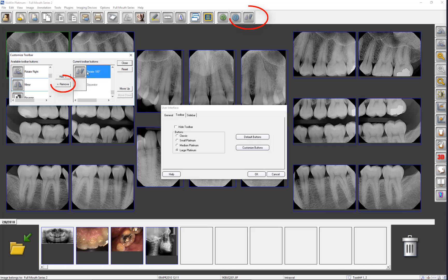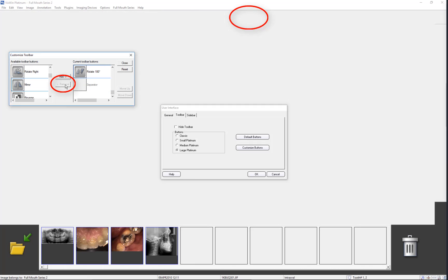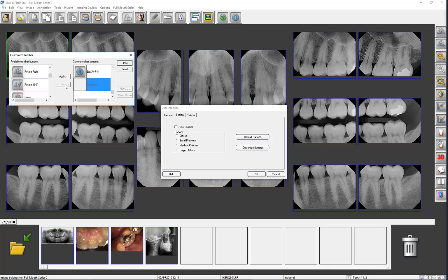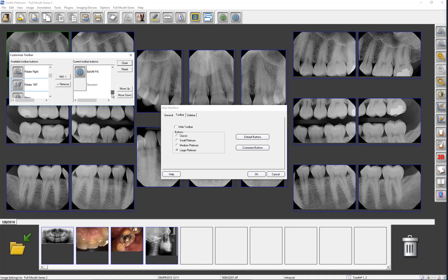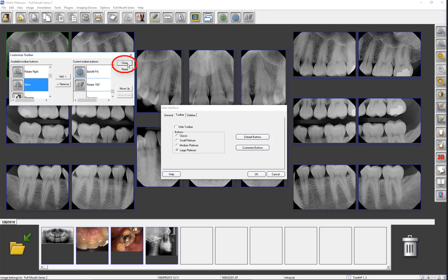Let's remove Rotate 180 degrees by clicking on it, then by clicking Remove. To rearrange the position of the button icons, click on the button icon to be moved, then click the Move Up or Move Down button until the button icon is in the desired position. You can also drag the buttons if desired. Let's again add Rotate 180 degrees by dragging the button from Available Buttons to the current toolbar buttons. The button now reappears on the toolbar.